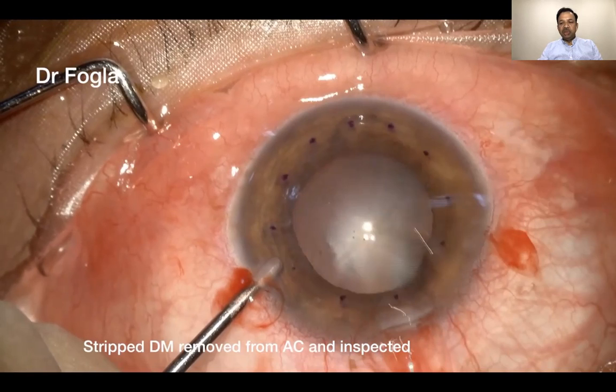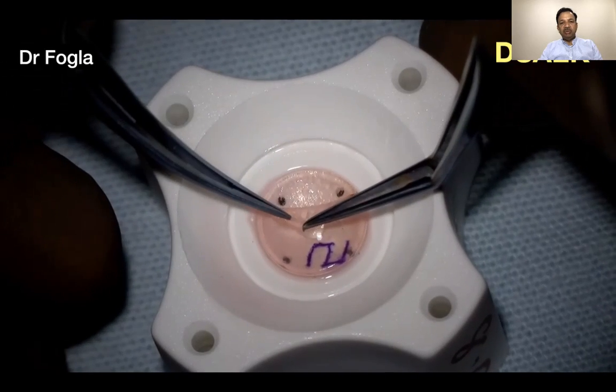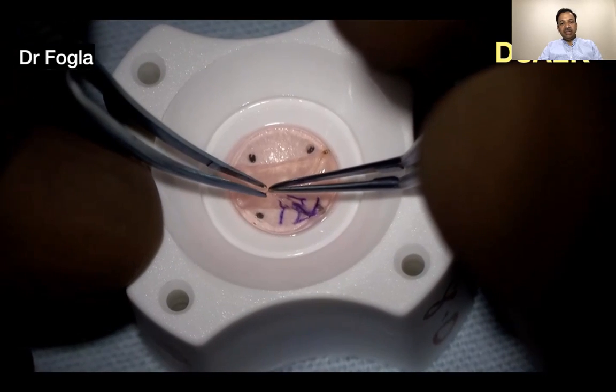Keeping the pupil dilated against the red reflex, you can see the stripped Descemet's much better. The other way to remove it is to keep the anterior chamber filled with air, and then you can remove the Descemet's membrane. It gives you a very good contrast of the area from where the Descemet's has been stripped away. This is again just to show you an ultra-thin DSEK being performed, where the graft is quite thin, and it is not as easy to handle as a conventional DSEK graft.